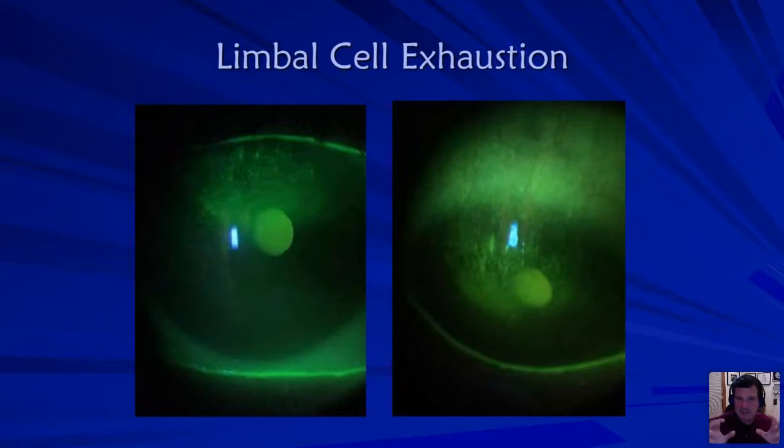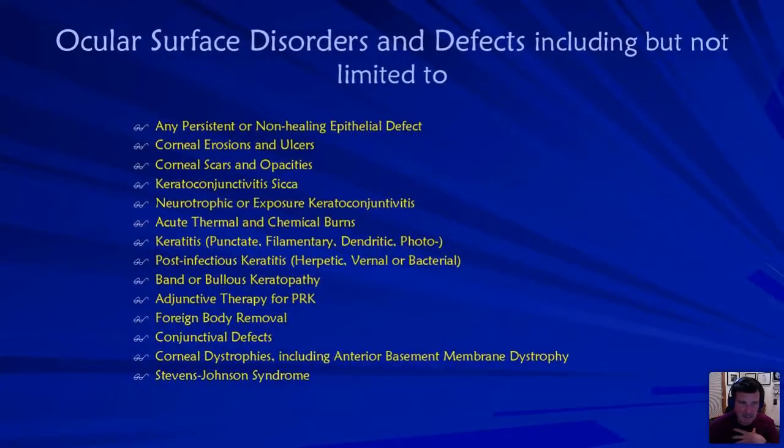It's stem cell-like activity. And this is a contact lens complication that could maybe take a year to heal, but you can really reverse it and make it a lot shorter when you use an amniotic membrane because you're healing that limbal cell. So this is one of those contact lens complications that I love using an amniotic membrane because of that stem cell-like activity from that amnion.